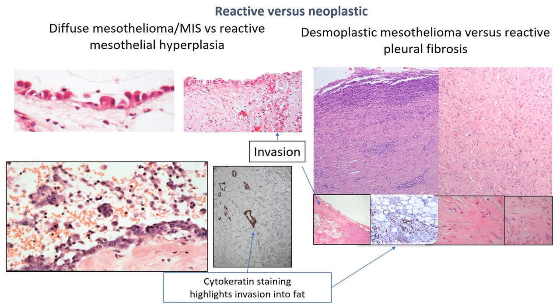And then there are other basic morphological and immunohistochemical features, such as irregular infiltrative architecture, collagen necrosis, mitotic activity away from the pleural surface, and irregular staining with cytokeratins. So it is very much morphology, immunohistochemistry, and morphology for this particular setting.